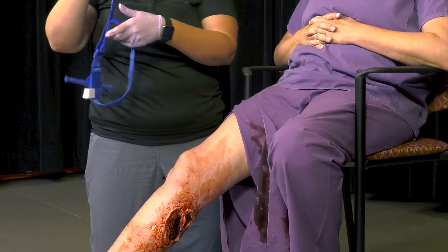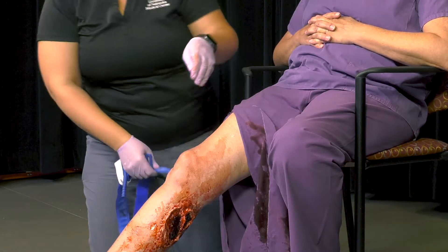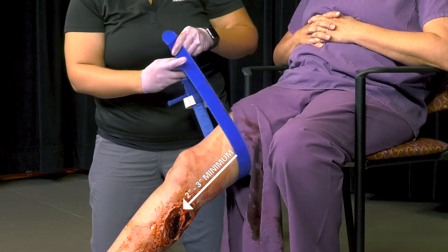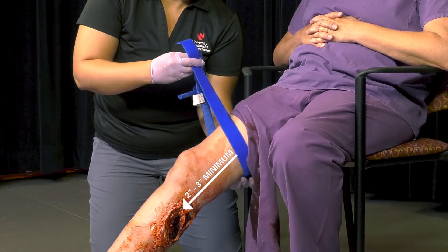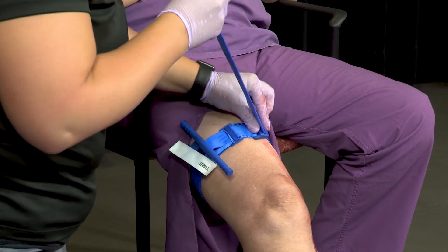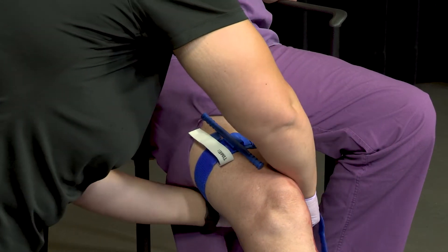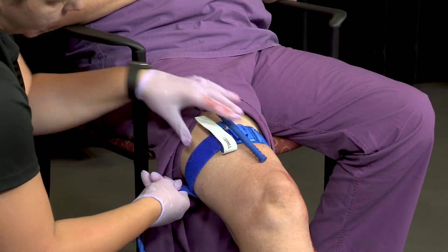Once you are ready to place the tourniquet, unbuckle the tourniquet, then wrap the band around the limb. Place the tourniquet at least two to three inches above the wound. Once you have the tourniquet in the correct position, thread the band through the buckle and pull as tightly as you can. It is expected that the victim hurts and may cry out in pain. Secure the band using the hook and loop fastener.